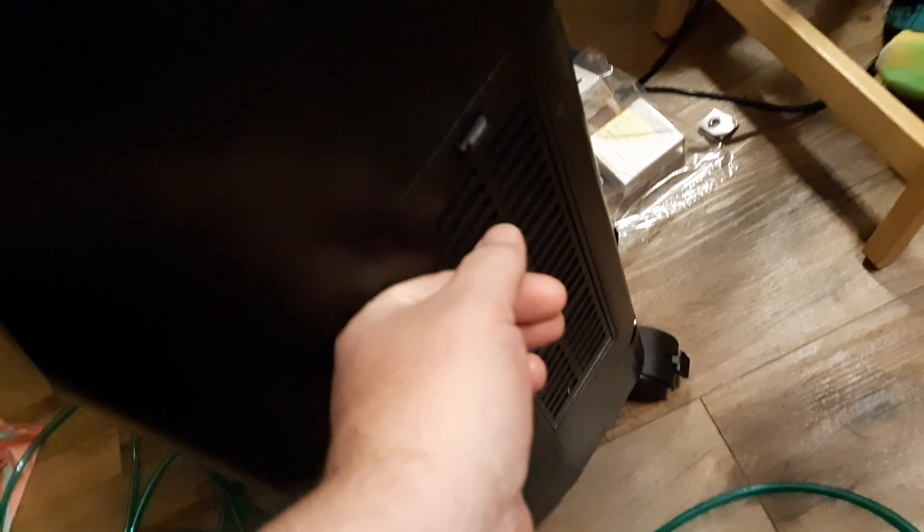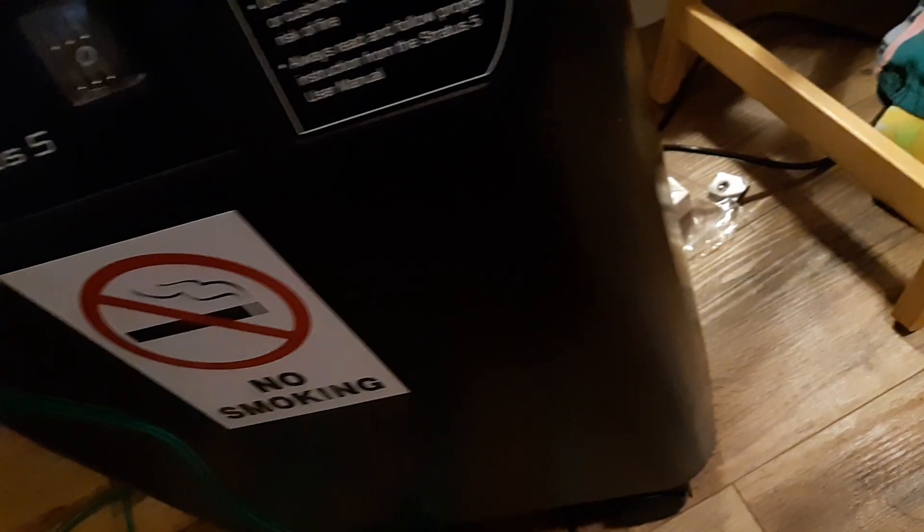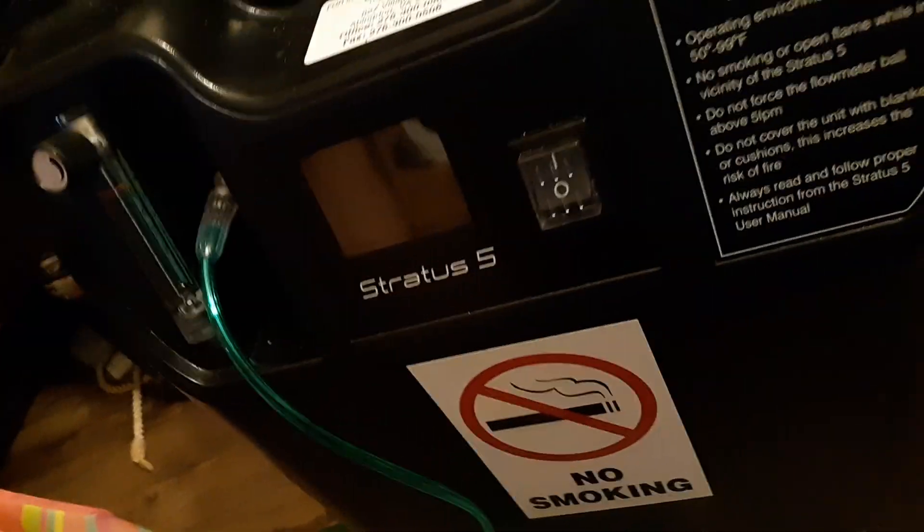If not, it could be an issue with the filter not getting clean air. Remove the filter — it's on the side and just pops off. Thoroughly clean it with water; use a spray if you have one. Then let it completely dry, either with a hairdryer or by air drying for several minutes up to half an hour, making sure it's not wet when you put it back in.